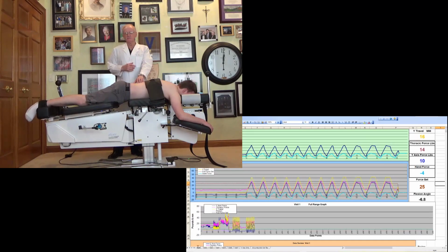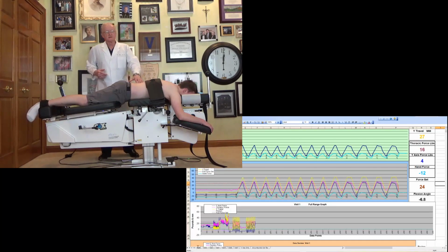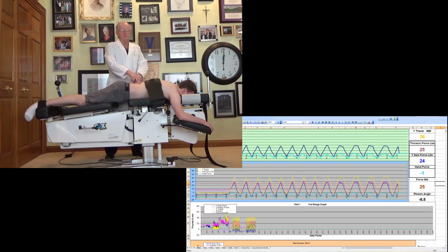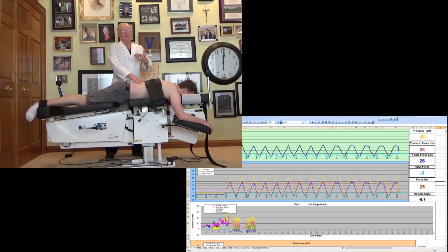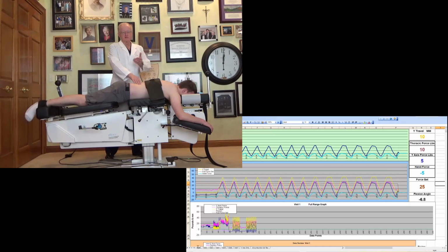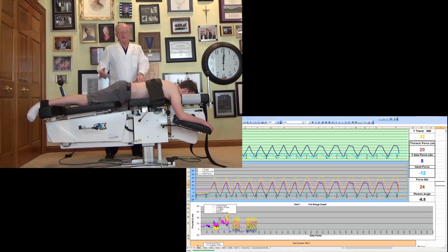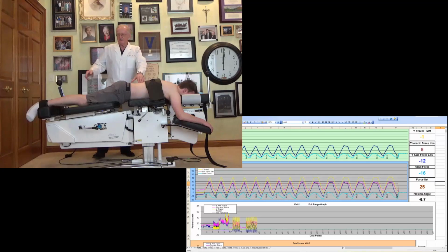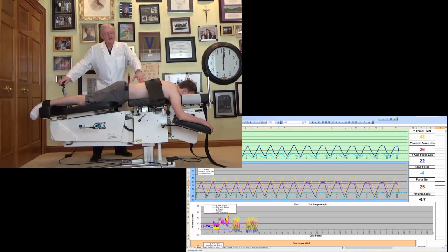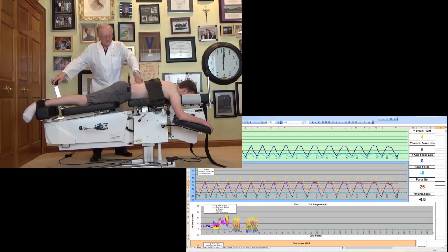I can also apply electrical currents. Say I wanted to put tetanizing current on the paravertebral muscles to stimulate and relax muscle tightness and stimulate myofascial trigger points. I can apply that electrical current under long Y-axis distraction and also apply lateral flexion as long Y-axis is delivered.